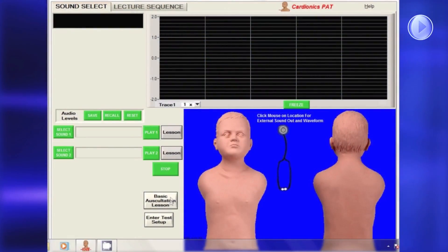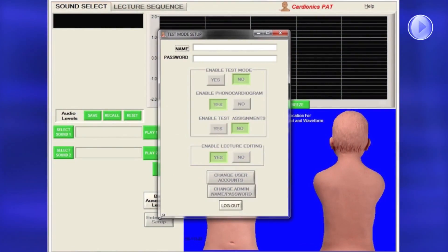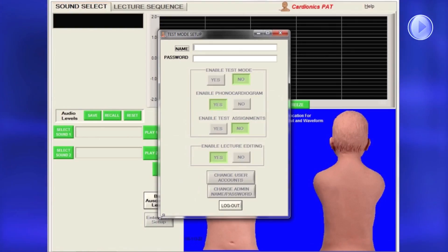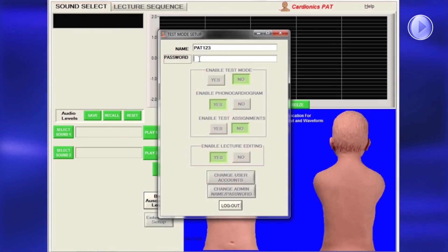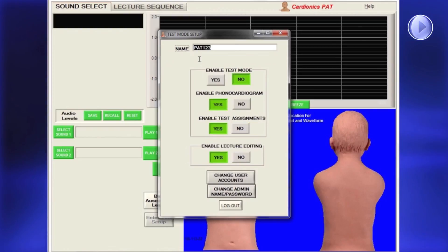Access administrative tasks from either the Sound Select page or the Lecture Sequence page by clicking on Enter Test Setup. For first-time setup, type PAT123 in the box labeled Name, and go to PAT in the box labeled Password, then press Enter.